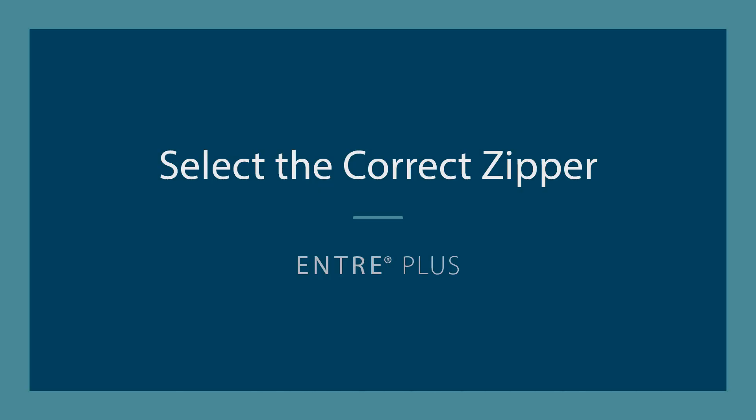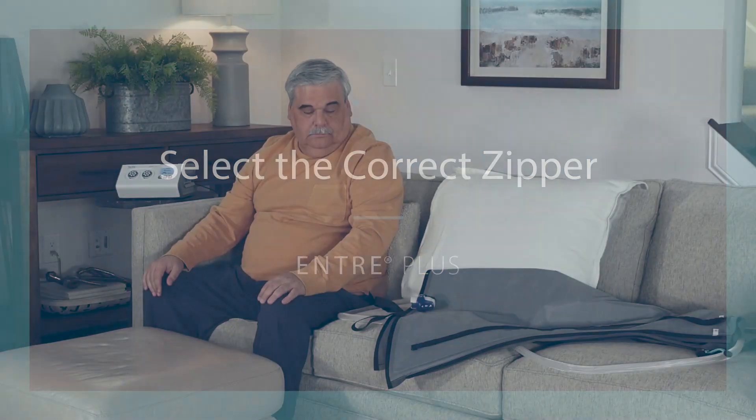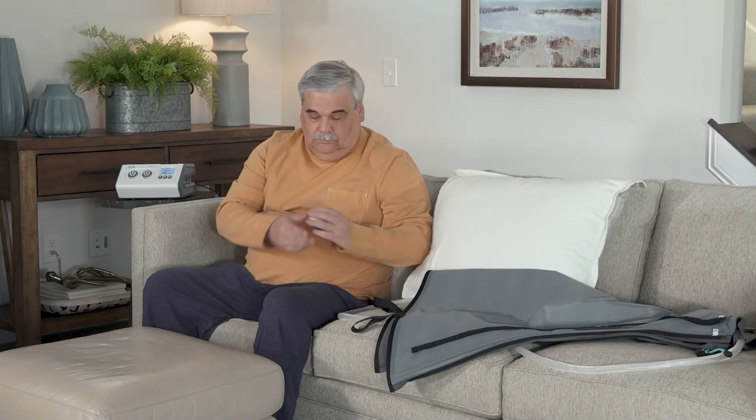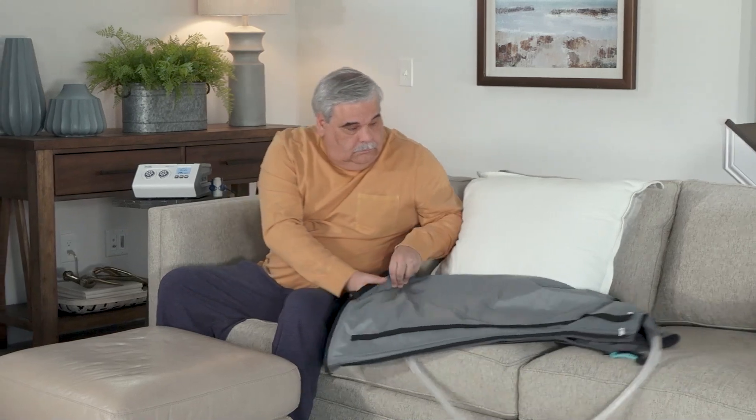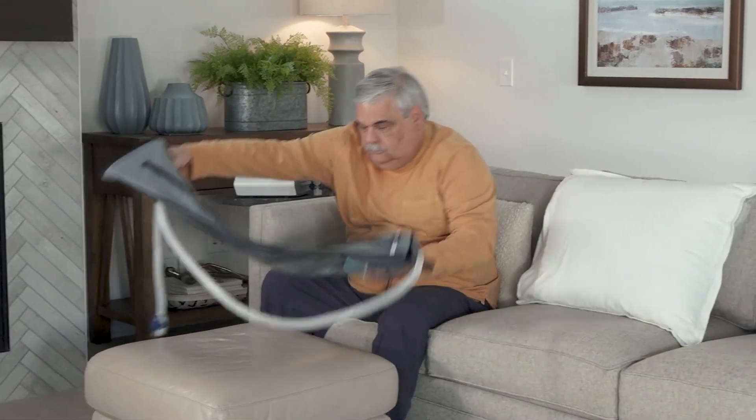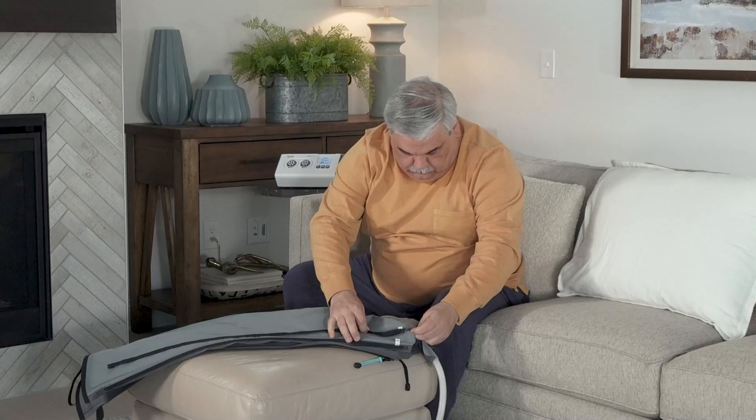Select the correct zipper size on your garment to ensure a snug but not tight fit. Refer to your treatment card for your size and review the instructions on how to configure the garment to fit your limb.